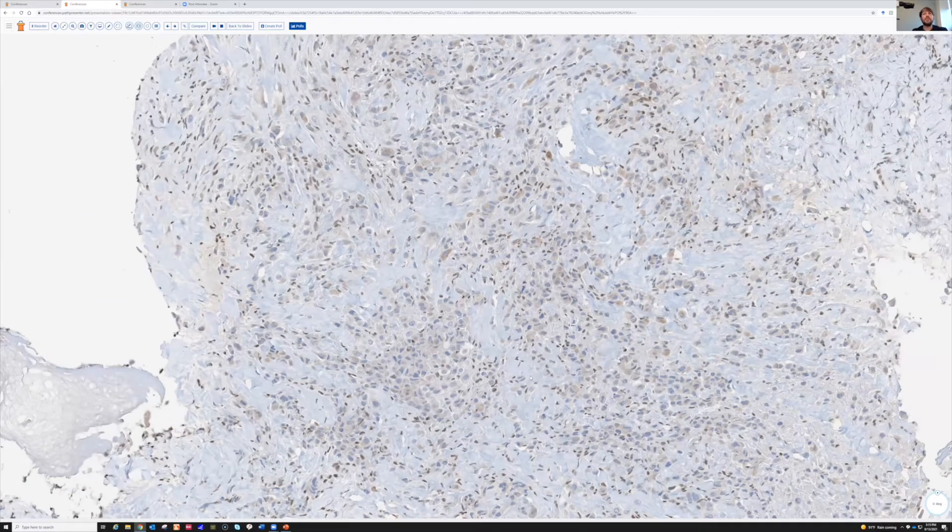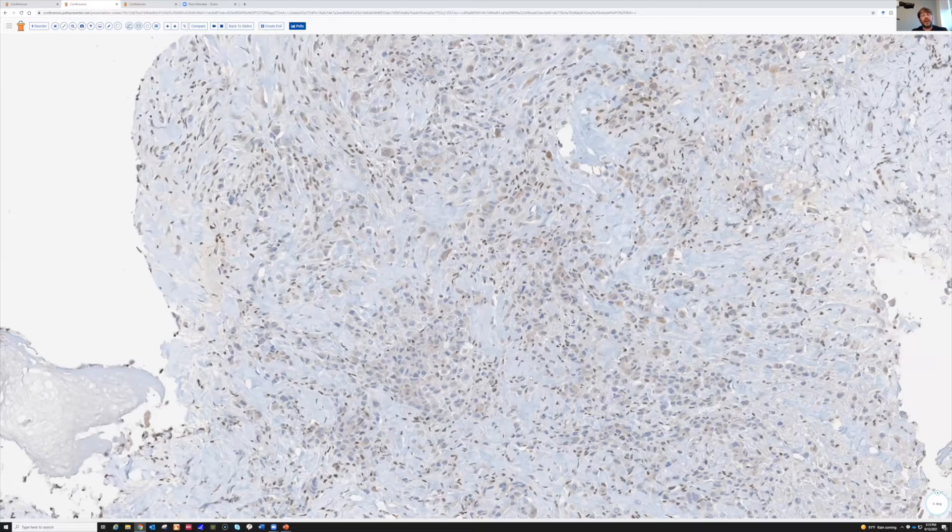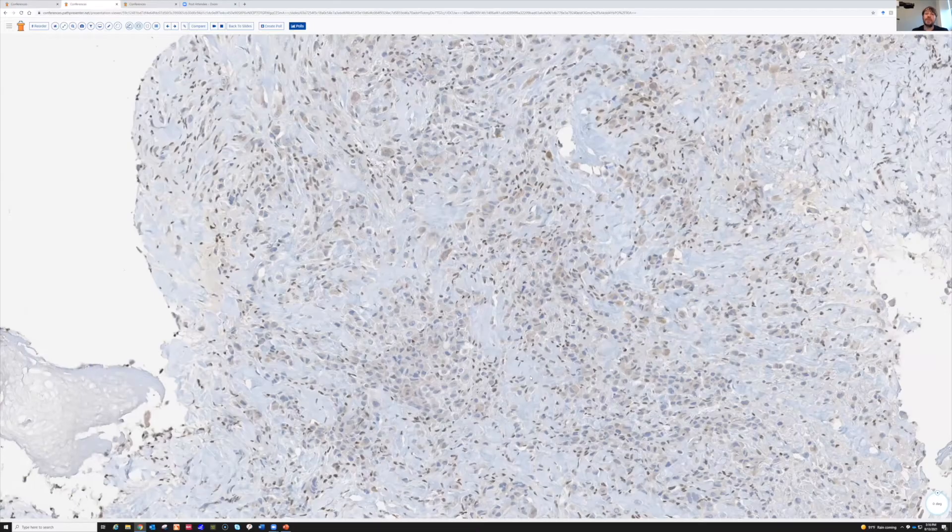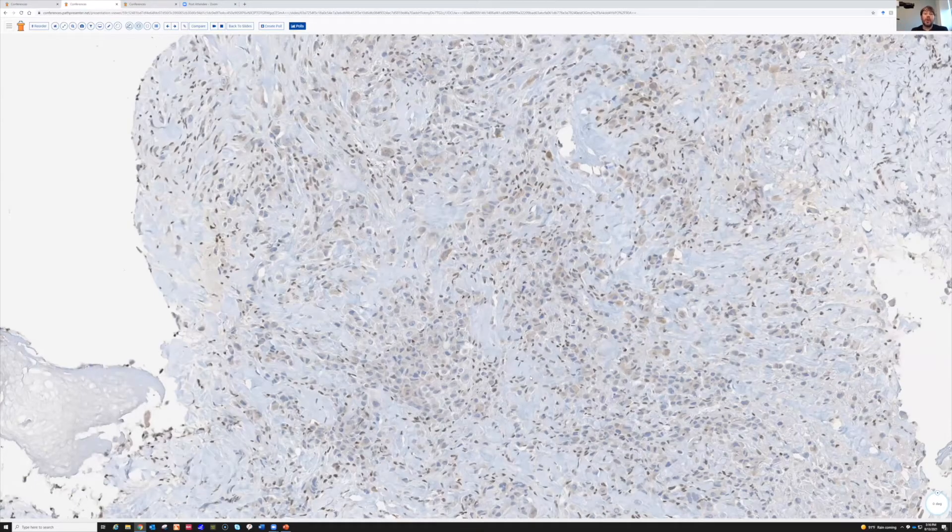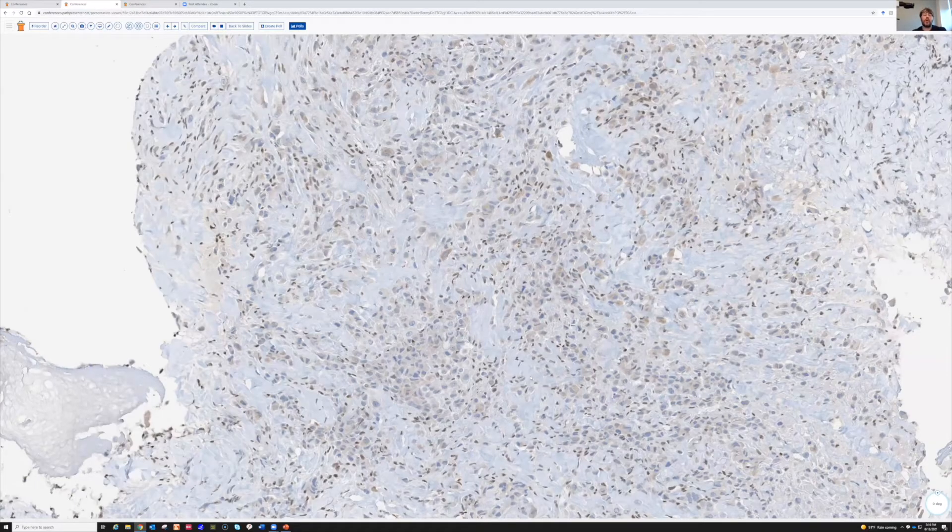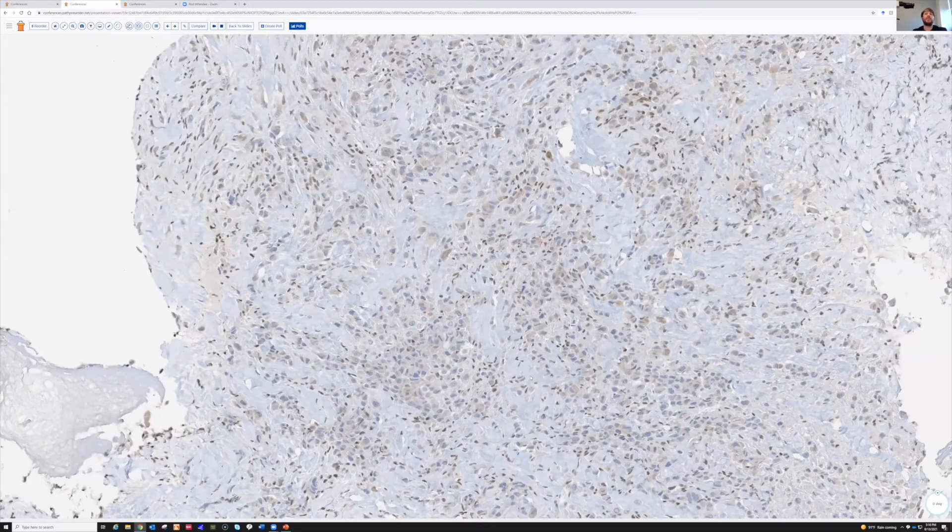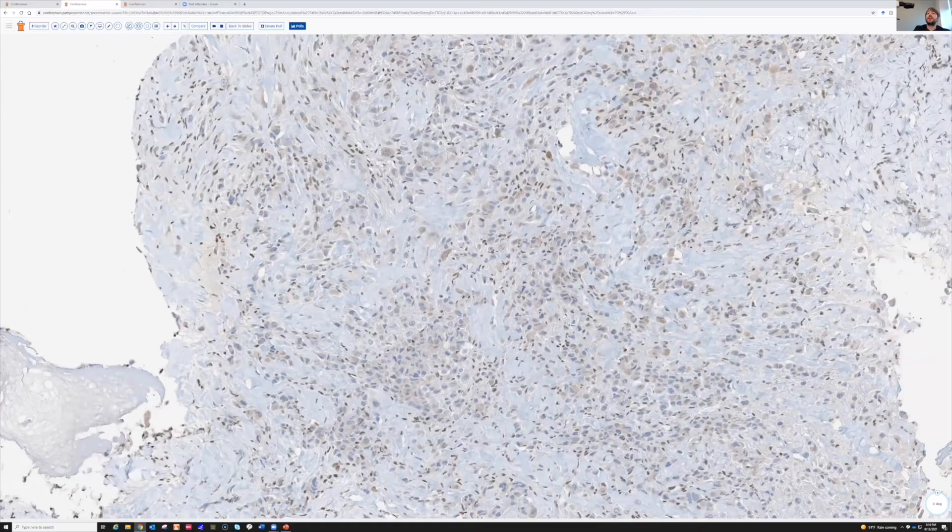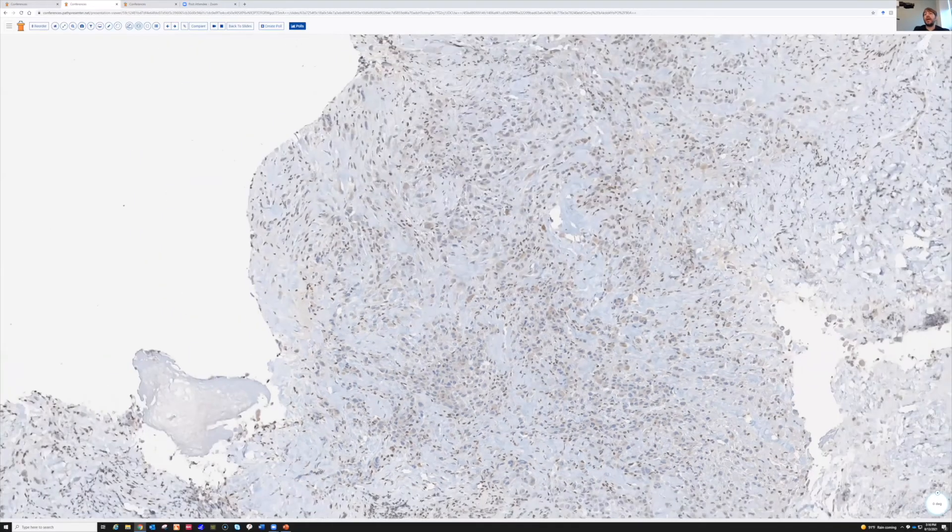So sometimes you might have the differential between an epithelioid sarcoma and an epithelioid angiosarcoma. Both of them can be keratin positive, and both of them can be ERG positive. So do keep that in mind that if you're thinking about a vascular thing, just remember that this will sometimes stain or oftentimes will stain with ERG, and don't mistake this for a malignant vascular tumor.